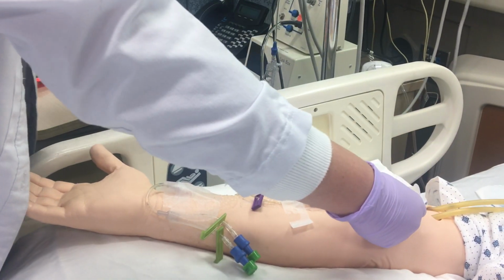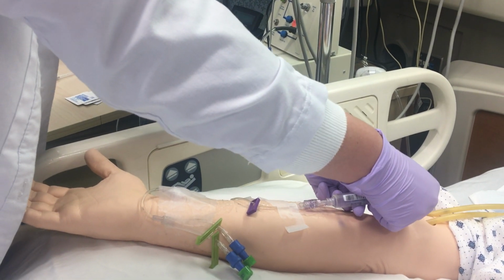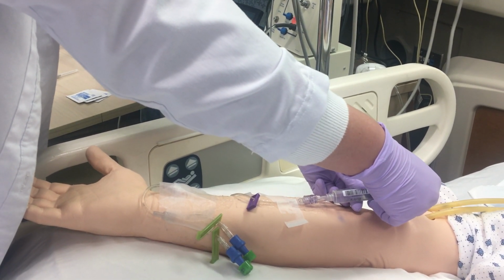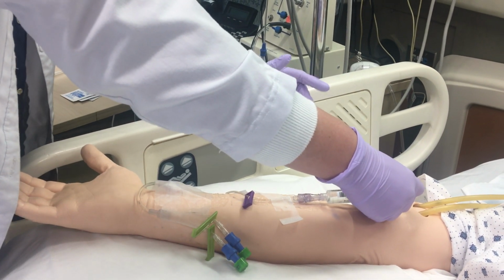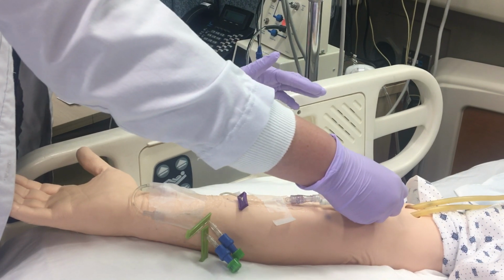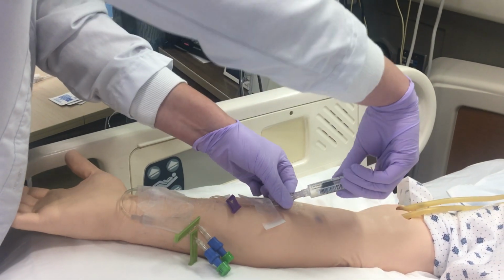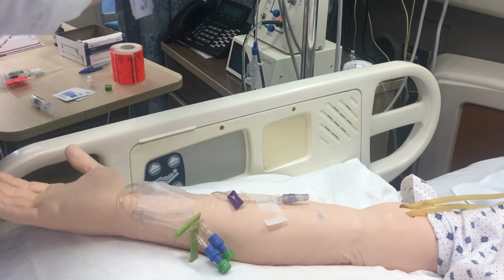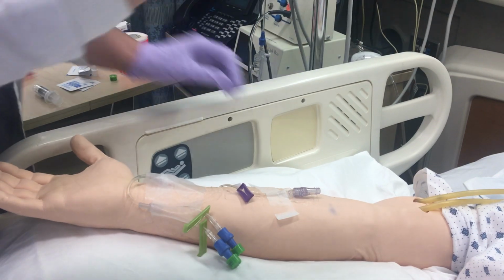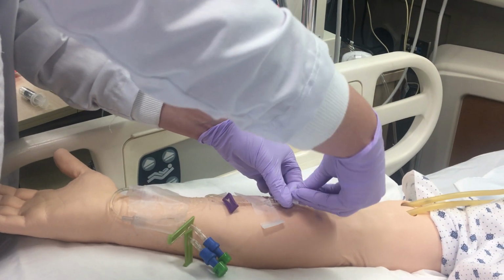Now, prior to the administration of this saline, I'm going to assess for blood return by pulling back slightly. I see blood return and I'm going to administer. Remember that oftentimes with peripheral lines, you may not see blood return, especially if the catheter is small. In between each syringe, I am going to cleanse with an alcohol swab for 15 seconds.